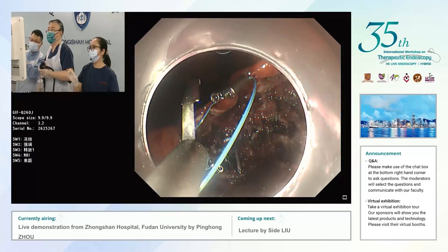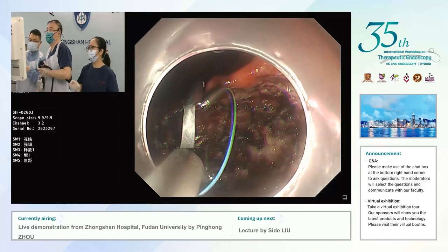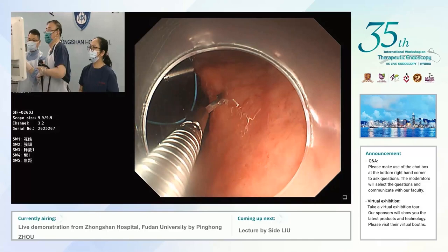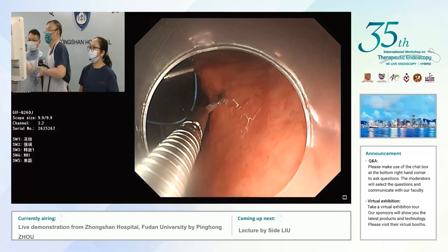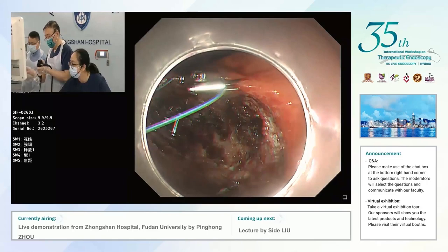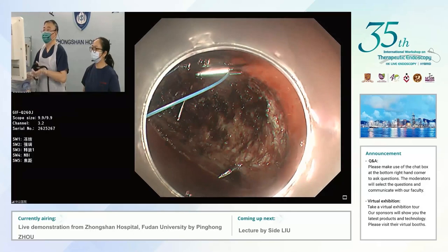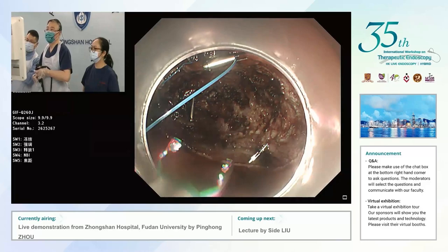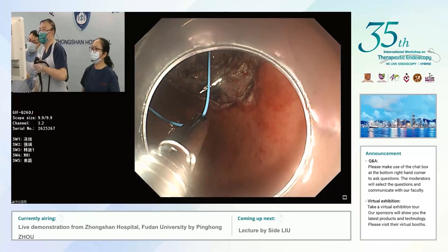You need good control of the direction of the clip. Our nurses will rotate the clips so they can find an ideal angle to mount on the edge of the lesion. The wound is very big — the end loop looks so small.